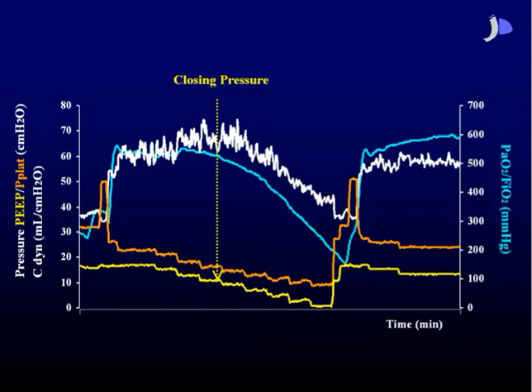We performed a new recruitment maneuver and finally established the steady state ventilation with a PEEP level 2 centimeters above the closing pressure, in this case 16 centimeters of water. And so for the next period of time, we were able to maintain the gain in compliance that we see compared to the beginning and a plateau in oxygenation.